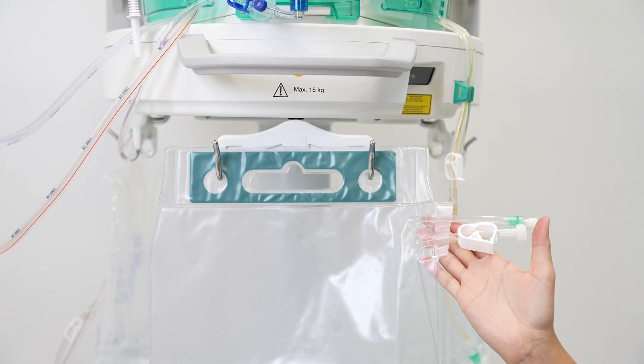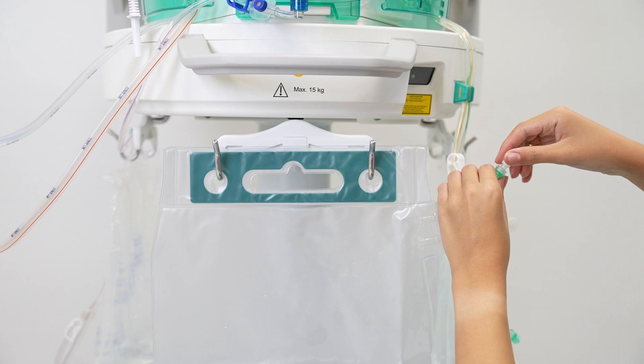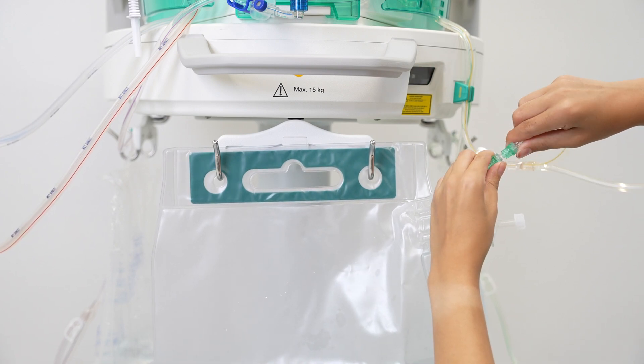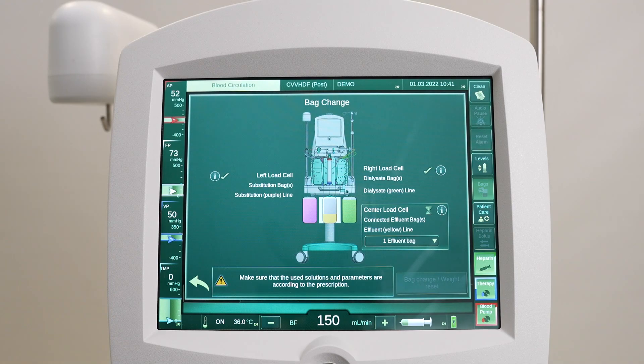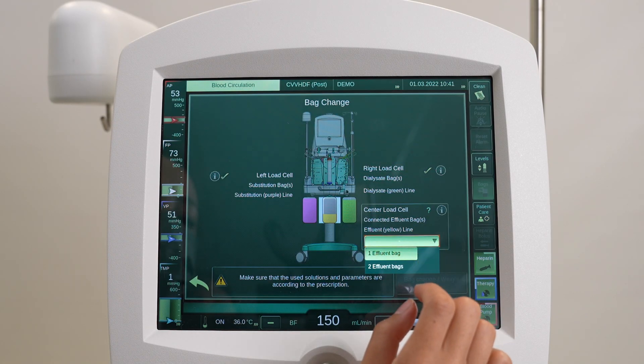Make sure that the inlet is on the right side of the bag. Remove the cap and connect the effluent line to the effluent bag. Close the drain outlet and open the clamp on the effluent line. Select the correct number of effluent bags and confirm it by pressing the bag change weight reset button.